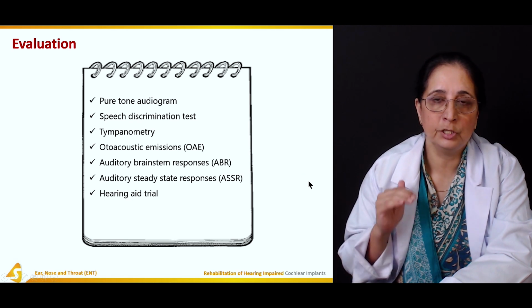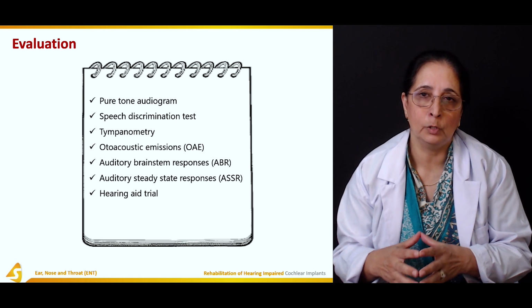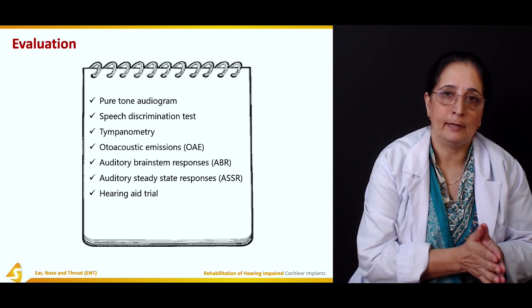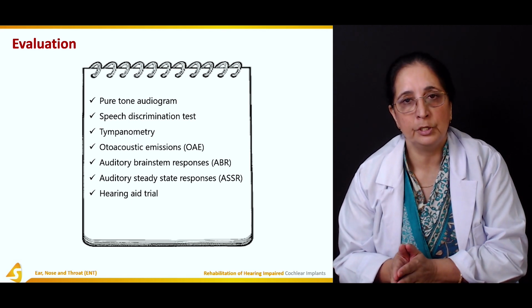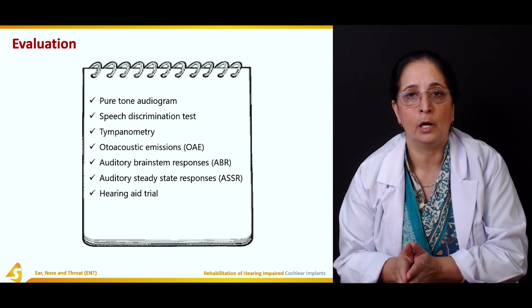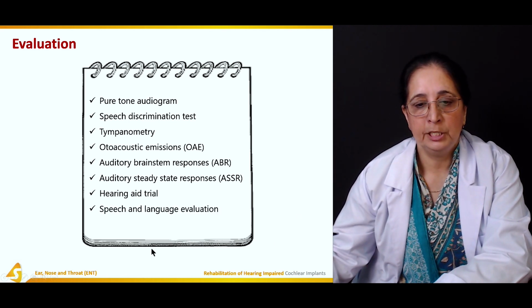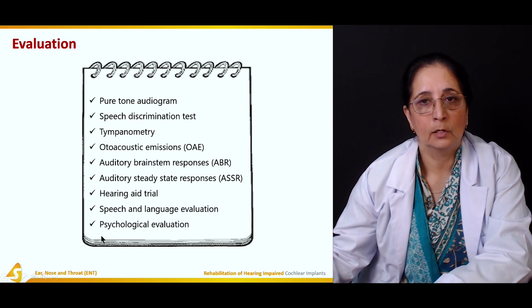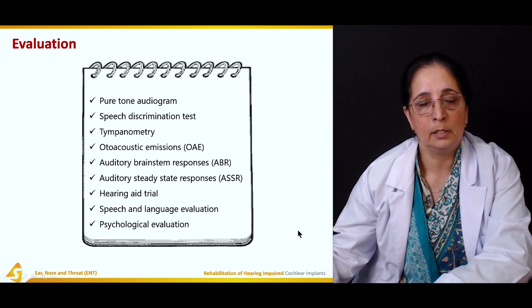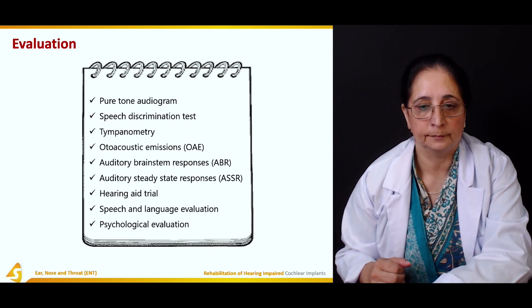So evaluation should be performed to find out how much it helped the individual, what the test evaluation was before the procedure, what the evaluation is after the procedure, and to what degree it helped. Speech and language evaluation and psychological evaluations. All these evaluations should be performed after the procedure.